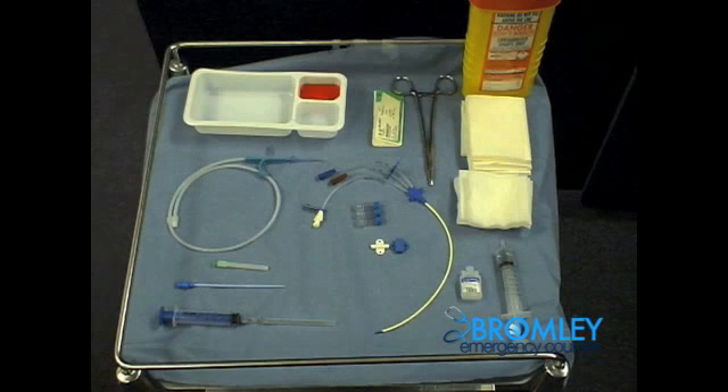Take some time now to familiarise yourself with the equipment shown above, as you will be expected to use all of this equipment in the examination.